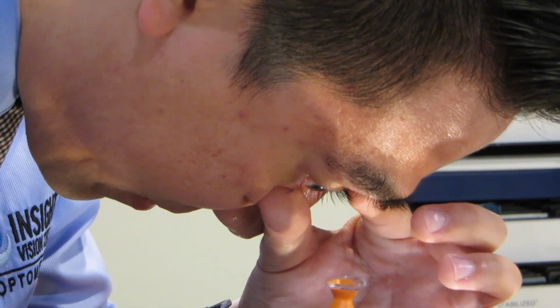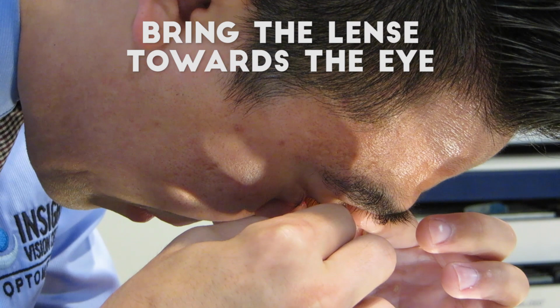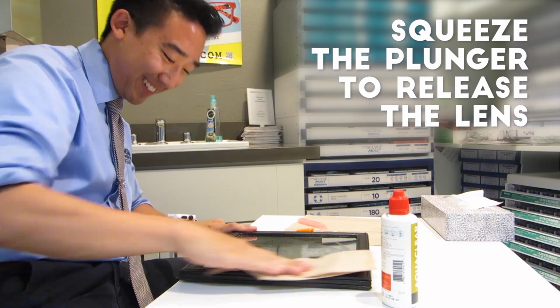Step 8. Gently bring the lens towards the eye. When you start to feel the liquid, don't stop, but keep pushing in until you feel the lens sitting firmly against your eye. Squeeze the insertion plunger to free the lens and close your eye slowly.